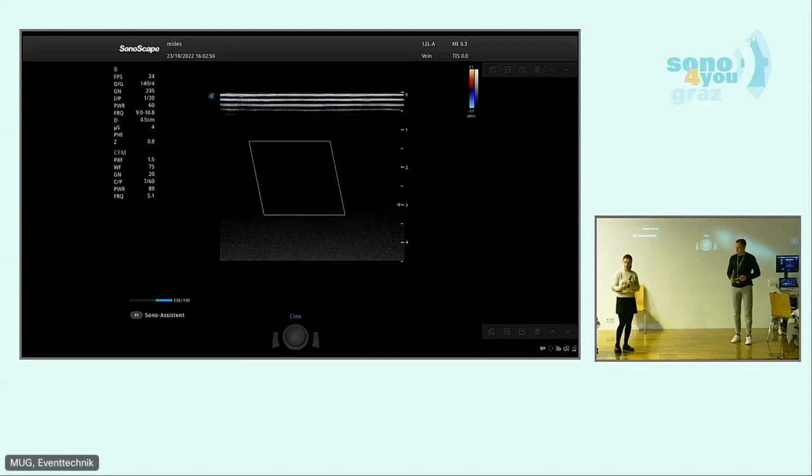So it is always taking time, and when you have time, use it. I can do it really quickly, it's not a problem. It's also like eFAST. Just think of compression and looking really and saying yes, no. But if you want to look at every vein, so it's like worst case scenario, 1 hour. Okay.